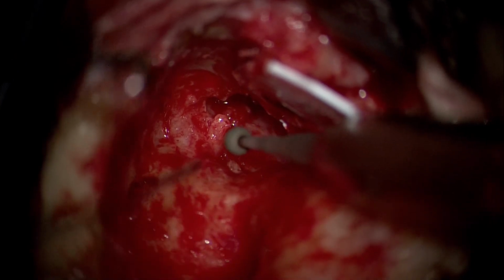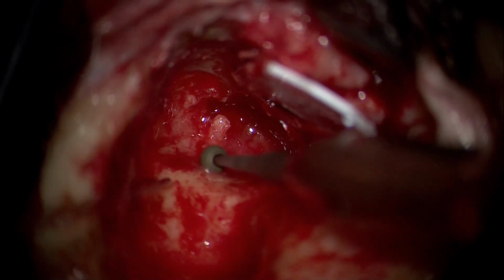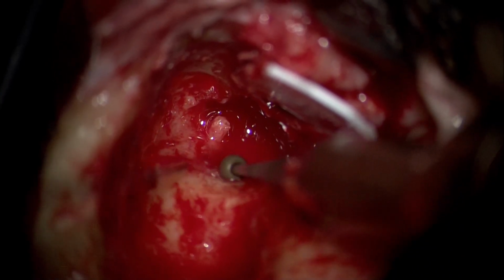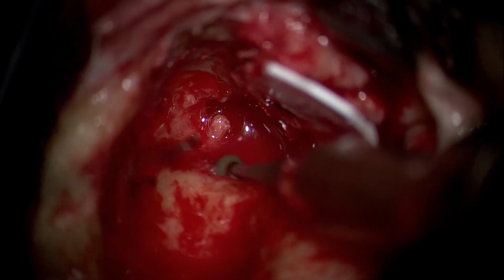And what we see is that our vision posteriorly of the sinus tympani region is still limited because of the bone. So now we resort to drilling this bone further using a 2 mm diamond burr to obtain a better vision in this part of the mesotympanum for optimal disease clearance.